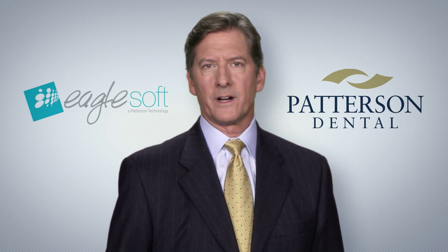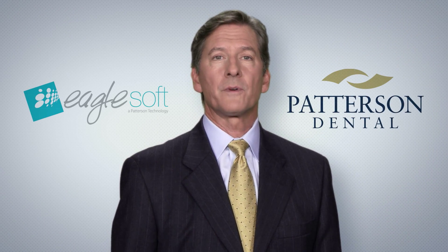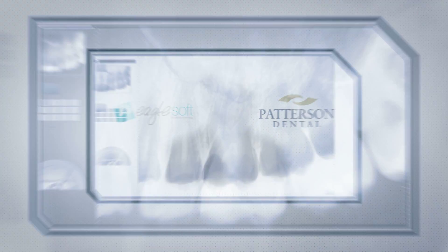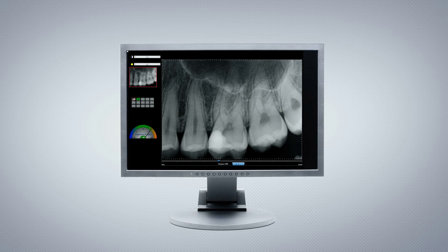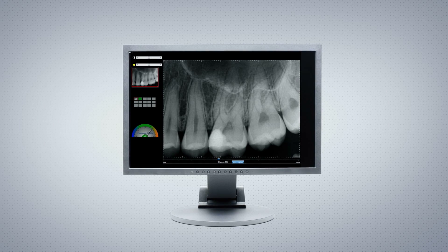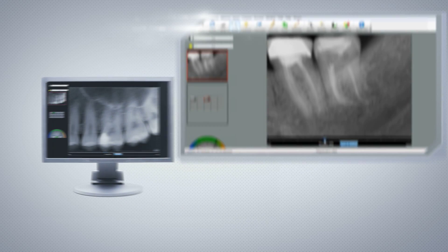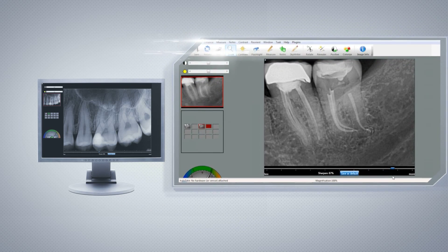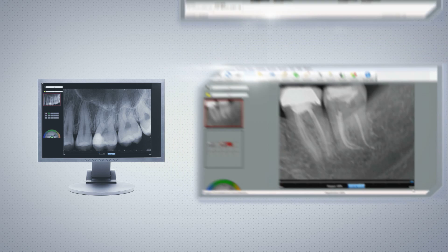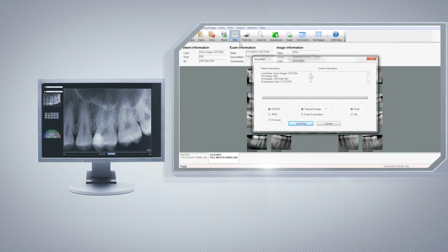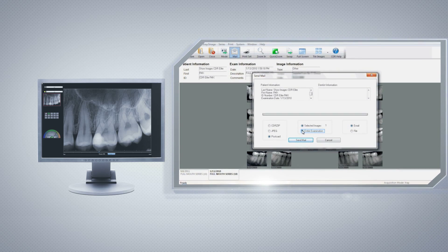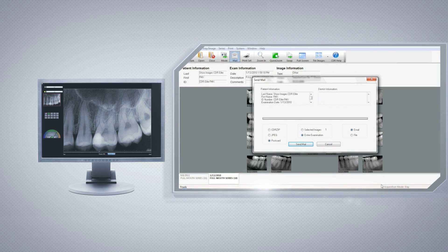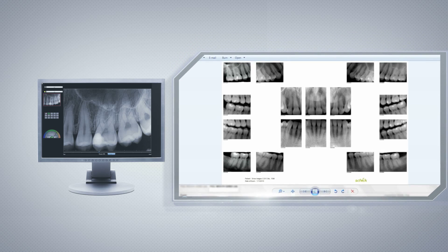Compatible with EagleSoft and Patterson imaging software, Schick 33 is also accompanied by CDR DICOM 5, the latest release of Schick's intuitive imaging software with features that include new image enhancement tools, viewing options, and multiple image sharing options to assist dental practices in communicating images quickly and easily to referring practices and for dental insurance purposes.